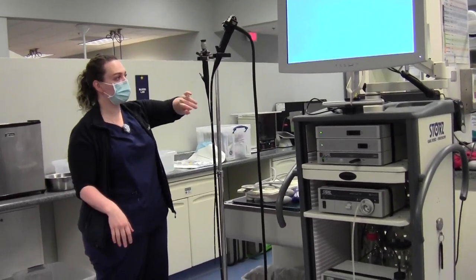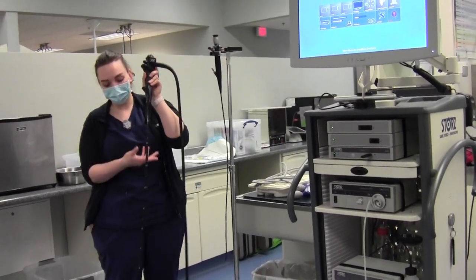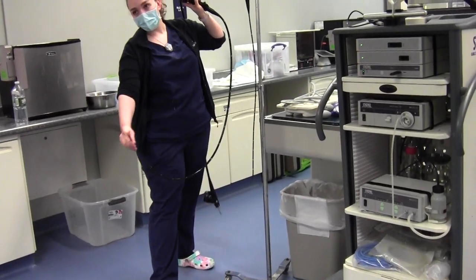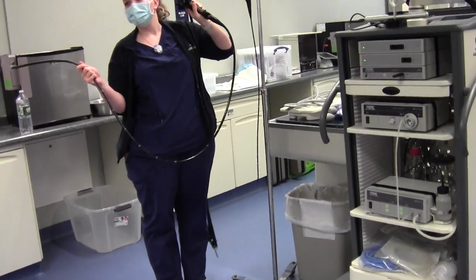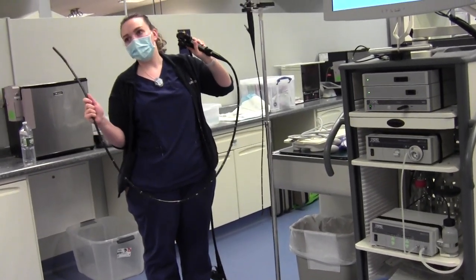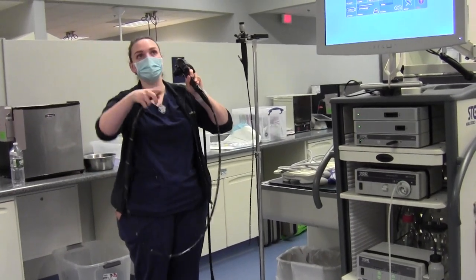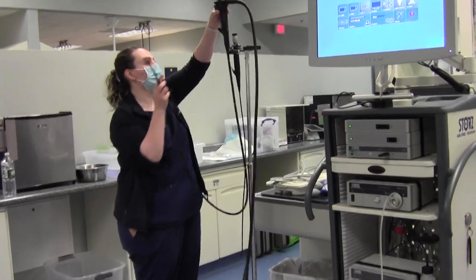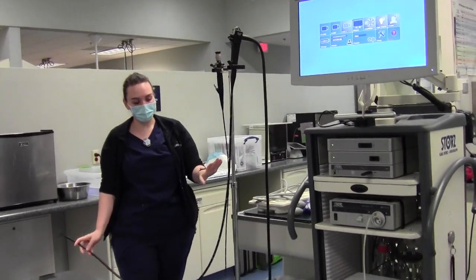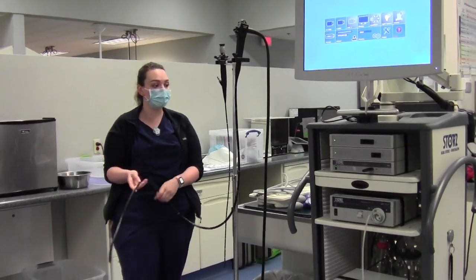The gastroscope, which is not here, looks exactly like this. This is the colonoscope, and you can tell that it is extremely long and much thicker. We do endoscopy on very large dogs, but mostly we use this super long one for colonoscopies because we have to get all the way up through the colon. The gastroscope looks exactly like this but is just a little bit shorter and thinner — that's the most common one that we use.